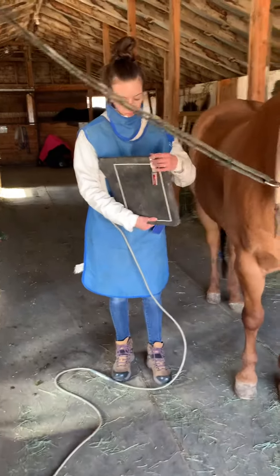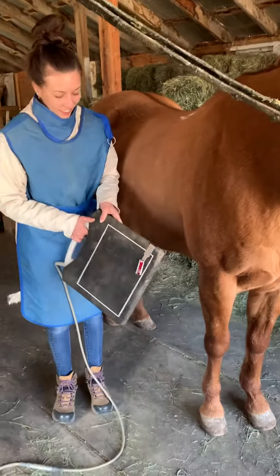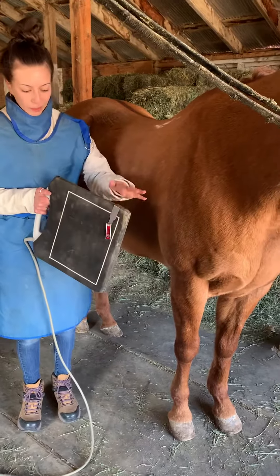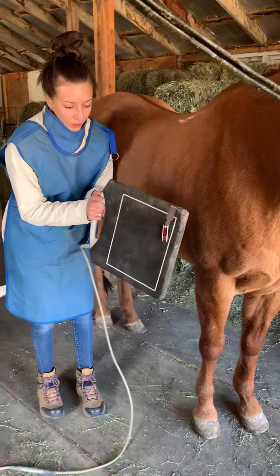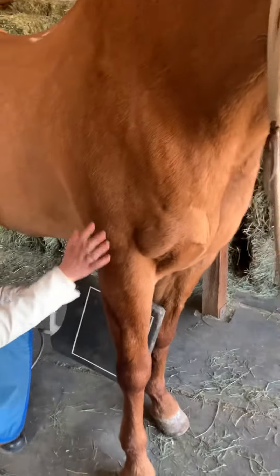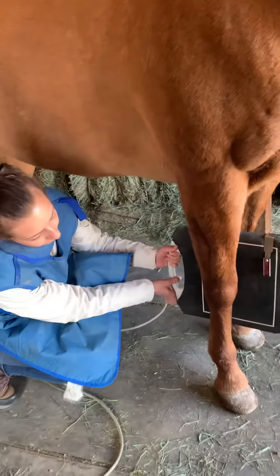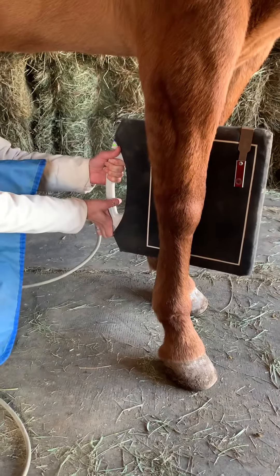Here we go. For the lateral view, we'll make sure the marker is up towards the cranial side of the body. I'm going to put the plate down here. I'm going to take a shot right here. Hold the plate. About there.